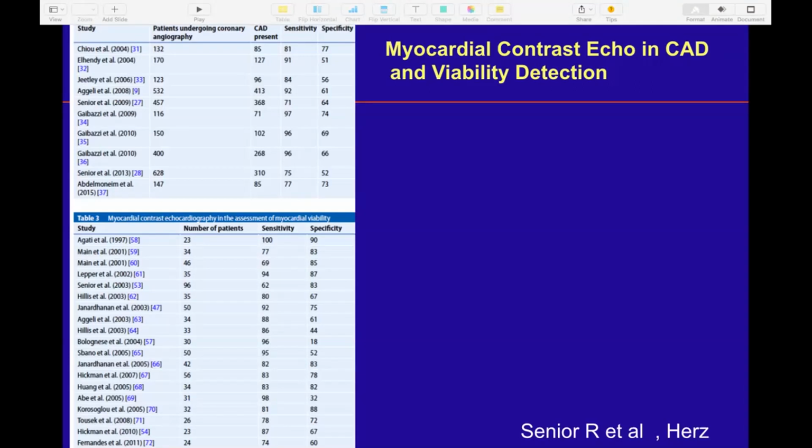That's because you're fundamentally evaluating perfusion with a myocardial contrast echo or nuclear, whereas you're looking at wall motion with echo. So understanding the difference is important because very often we take a patient with a positive perfusion scan or a positive perfusion myocardial contrast echo to cath, and we may or may not find obstructive disease.